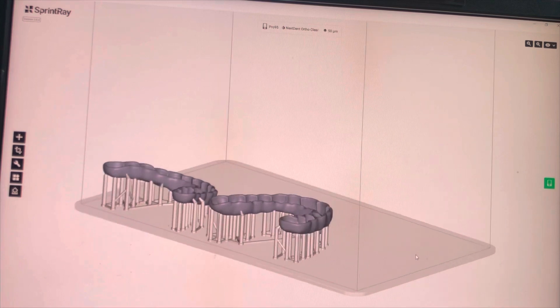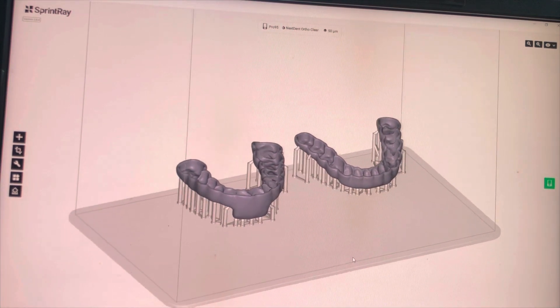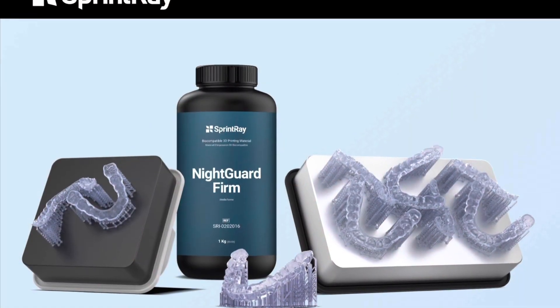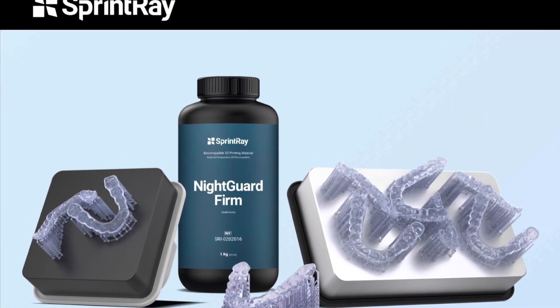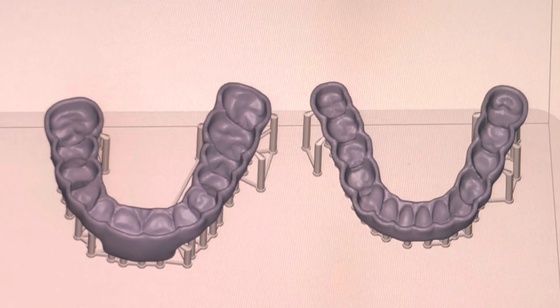This is the platform — the nest where we organize how this is going to be printed. Then we'll take the product, the night guard firm resin, and we'll start to print the case and get this done the same day for the patient.